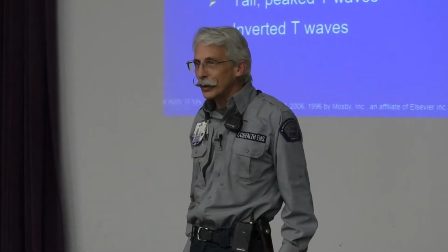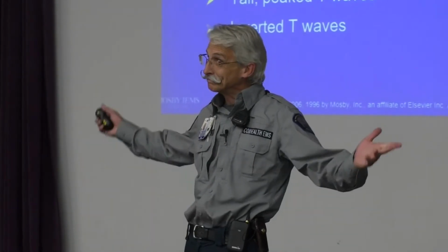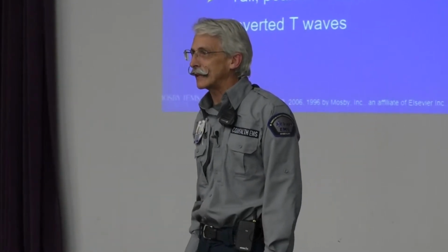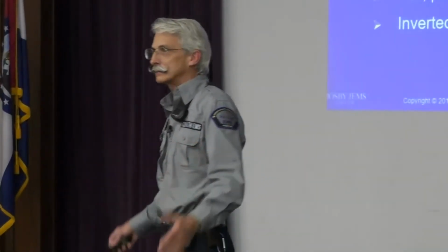Patients shouldn't die while you're reading their 12 lead. Yeah, well, it is. And that's kind of like shocking them into asystole because that's my rhythm, I know that one really well. Yeah. Epi, epi, epi, epi, epi. Yeah. Lots of help.